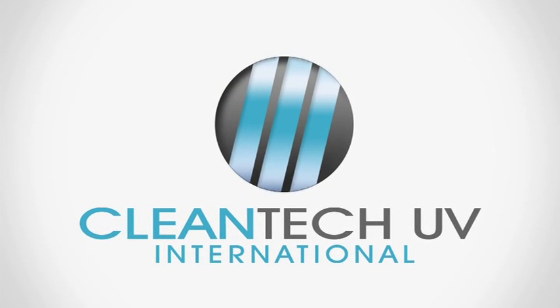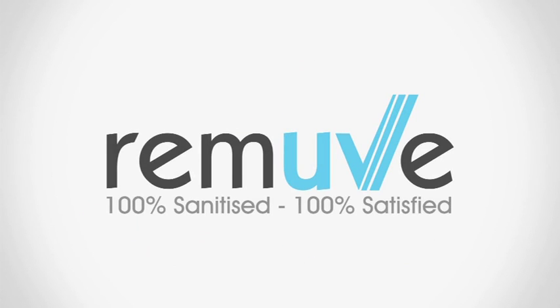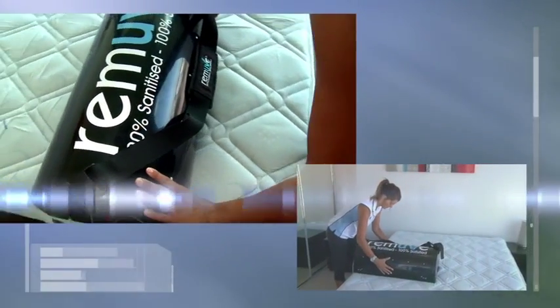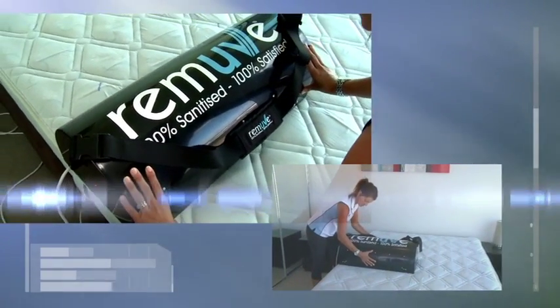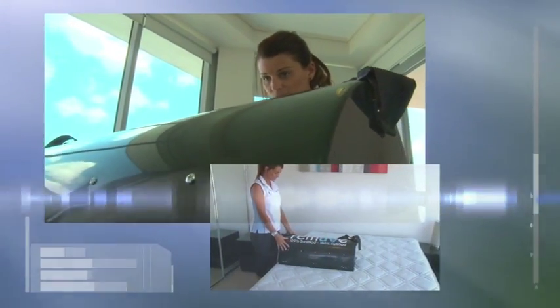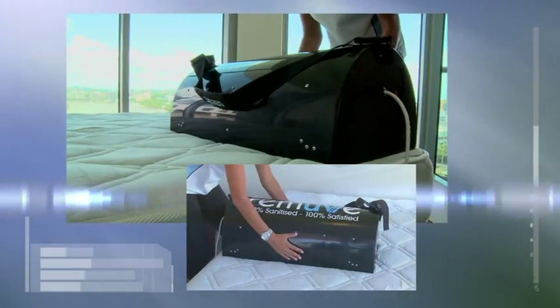Welcome to the Remuve training DVD. Here we'll demonstrate the operational aspect of sanitizing the mattress. Remuve is a one-of-a-kind product that uses powerful medical-grade UV radiation to help deep clean your mattress to a pristine and healthy sleeping condition.